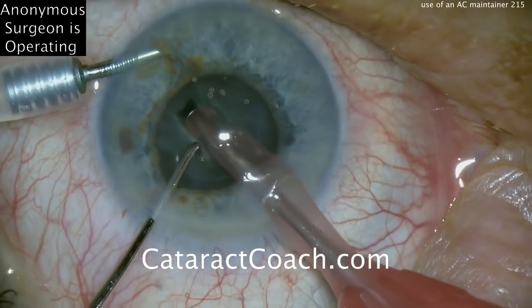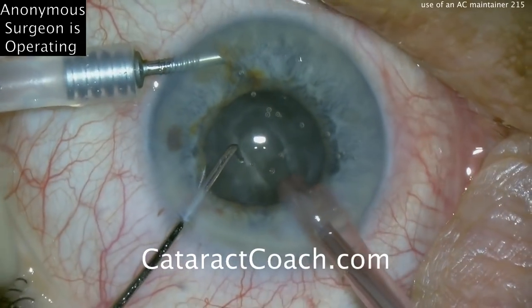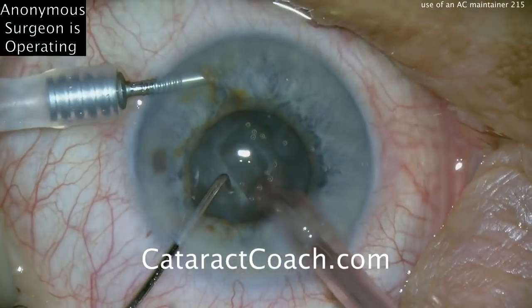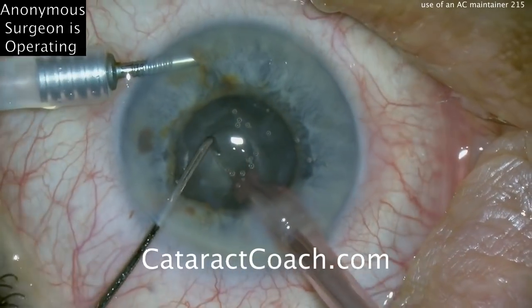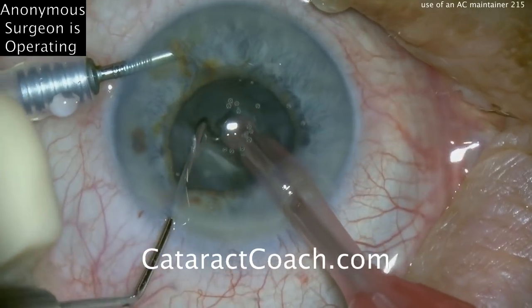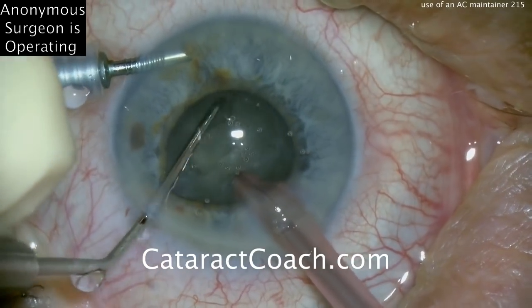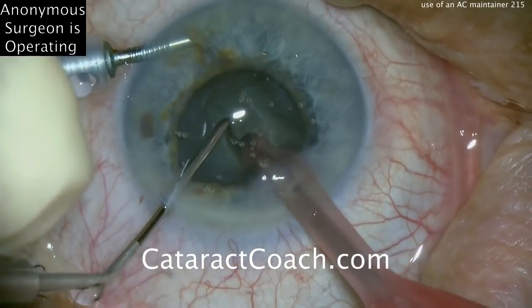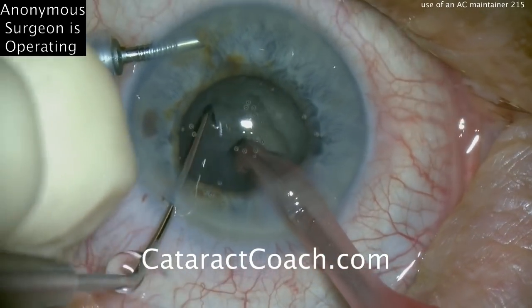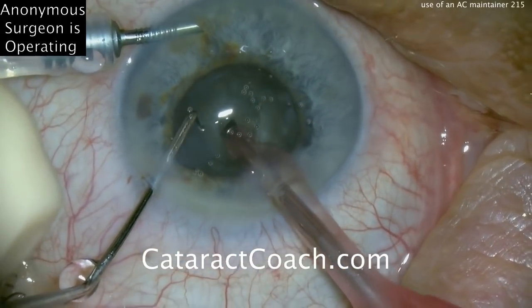In most of my videos you'll see me doing just a quick chop at the beginning of the case — I very rarely do this kind of grooving in the middle. The one advantage to grooving here is it actually debulks the central endonucleus, so the most dense part of the nucleus is debulked, which helps especially with a smaller rhexis or smaller pupil. We've got a partial crack of the nucleus into two halves with a little rotation, and we'll split it a little bit more. Remember, you have to fully separate the pieces — if there's a small attachment, it makes it more challenging to bring a piece up into the iris plane.